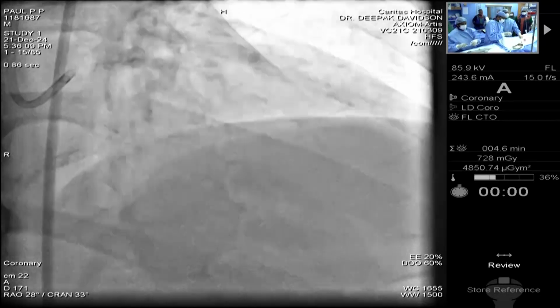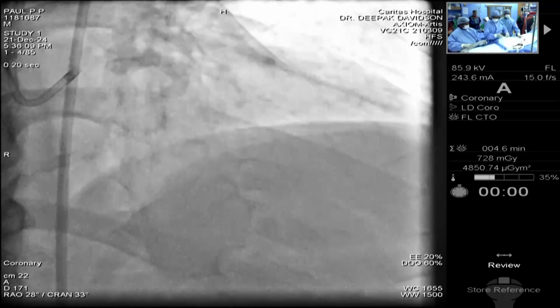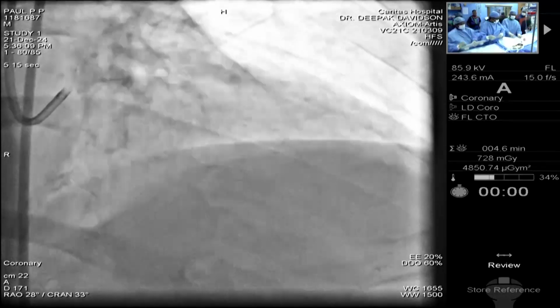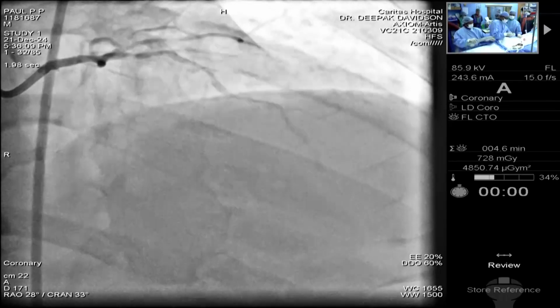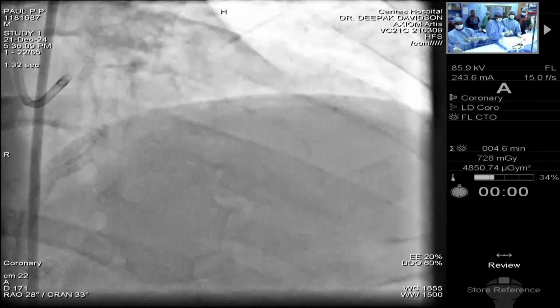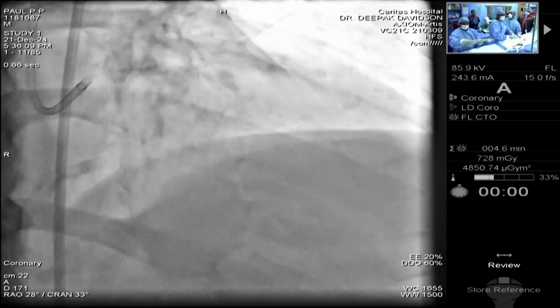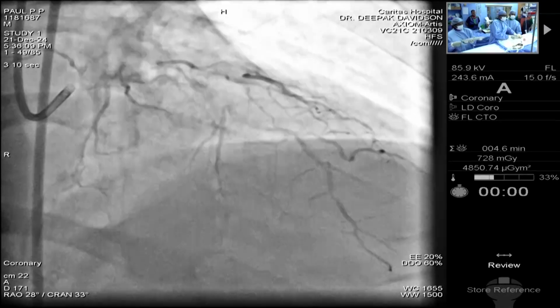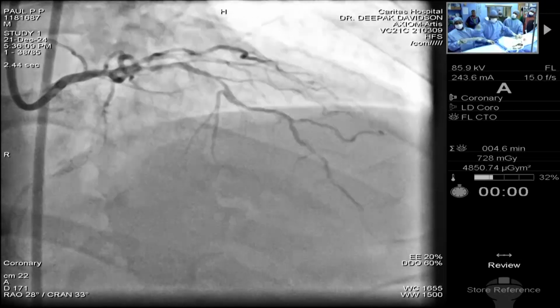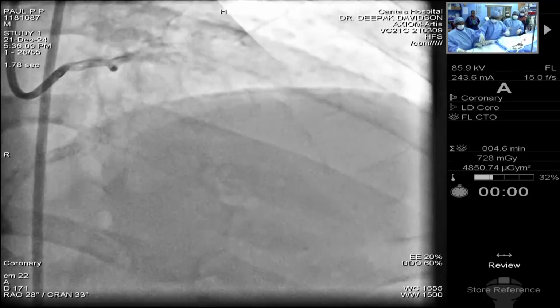Okay, so we'll check the device. We'll check all the parameters.